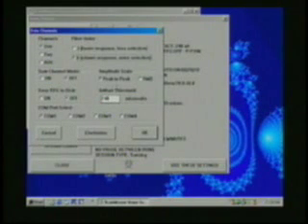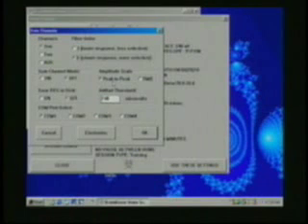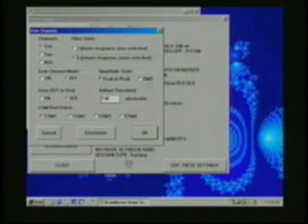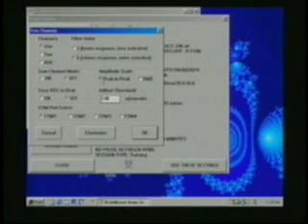We then have the amplitude scale. We offer two scales. One is peak to peak and the other is RMS for root mean squared and peak to peak is more commonly used so we're going to use that.